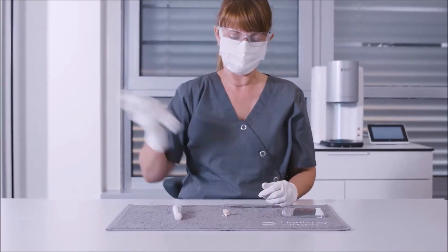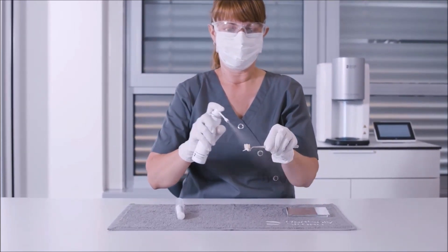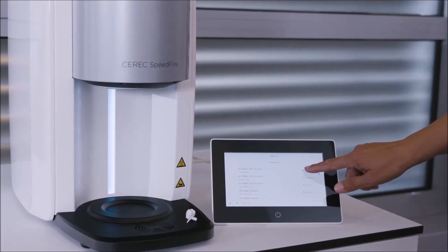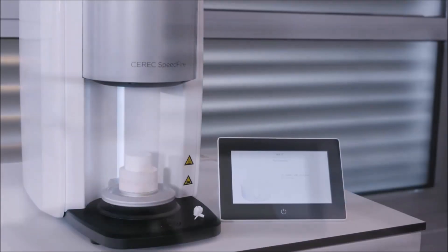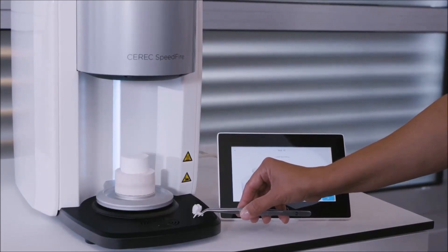The Dentsply Sirona Universal Spray Glaze must be shaken for at least 10 seconds before use. We wet the restoration surface all around from a distance of 6 to 10 centimeters from the nozzle outlet, making sure the spray is applied evenly. Next, we select the glaze firing for our restoration from the operation panel. Once the door has been completely lowered, we place the pin with the restoration on the upper door seal.